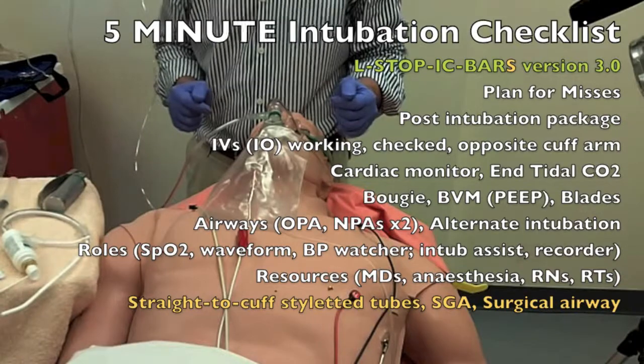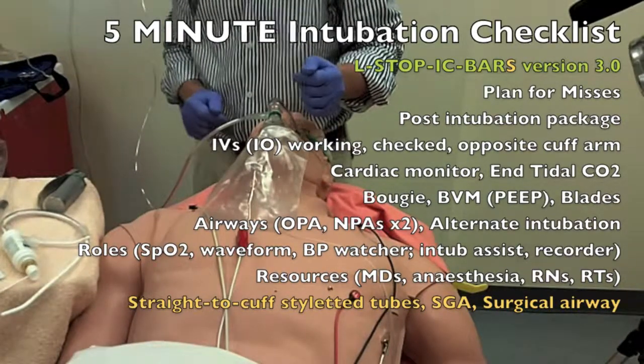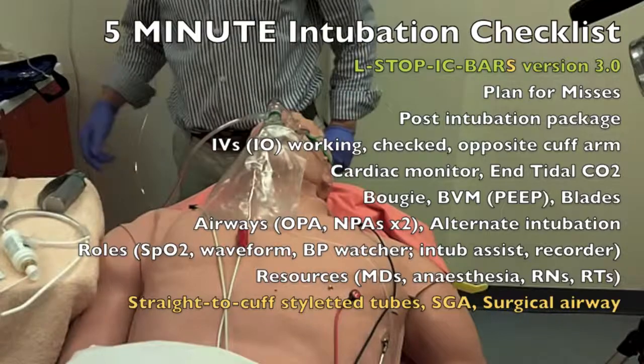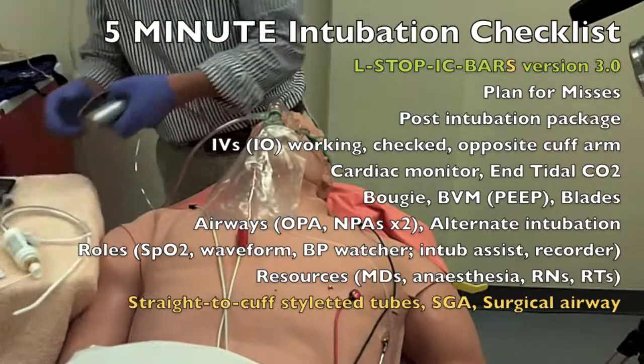Okay, good. And surgical airway. Yep, we've got that ready. So all that's right. That completes our checklist. Okay, so we're ready to go. We're good to go. Do you have a timer ready too? Sure, I can time this. Do you want to go ahead and give the ketamine? Sure. Ketamine's going, yep.